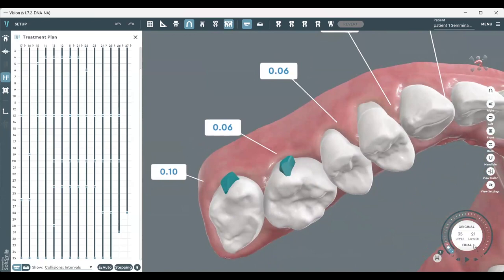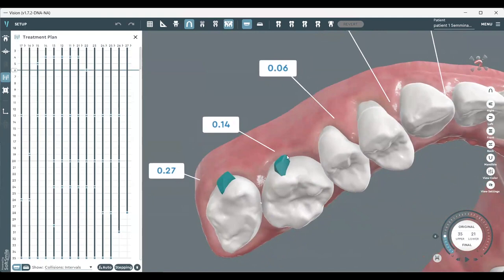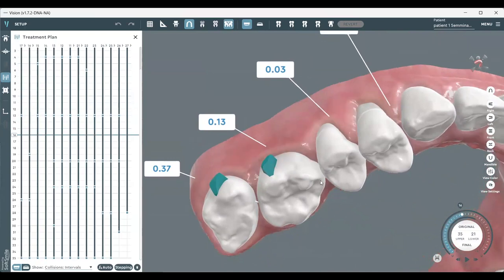So I started doing the rotation and passing the force here to make the distal out movement. You can see this is the active surface at this moment of the attachment, making the mesial part go out. Also, the aligner is going to create pressure, but also here it is going to create the forces.